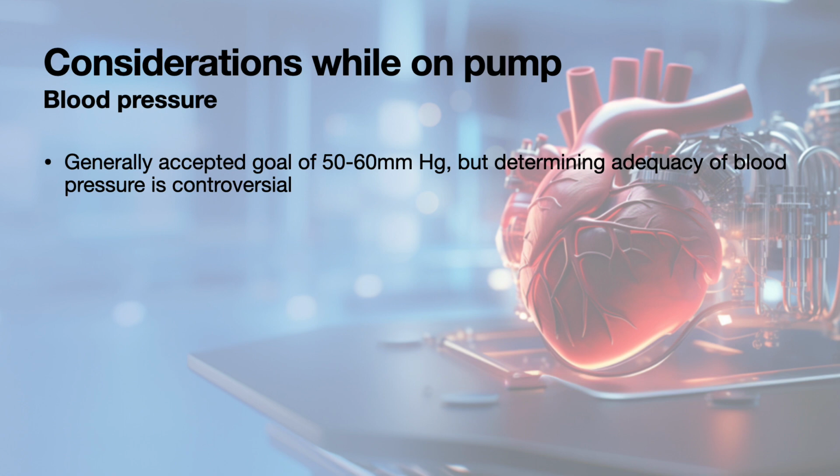To compensate for the fact that cold blood is more viscous than warm blood during hypothermic cardiopulmonary bypass, hemodilution is employed to ensure that the blood does not become excessively thick to preclude its passing through the small blood vessels without an extraordinary amount of pressure. This improved microcirculatory flow may increase oxygen delivery despite a lowered oxygen carrying capacity. And at any given flow rate, dilute blood will generate less blood pressure than thick blood.